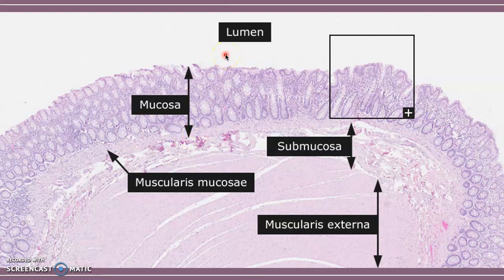You can see the lumen — that's where stool is passing through — and this is the innermost layer, the mucosa. It's called the mucosa because it has a lot of goblet cells, which are unicellular glands that secrete mucin. That mucin coats the surface to keep it from drying out and to lubricate it for the contents coming through. Over here you can see a little bit of hyperplasia, some extra cell growth.